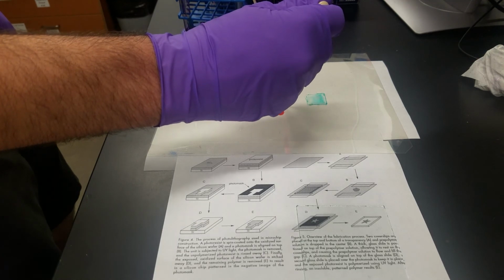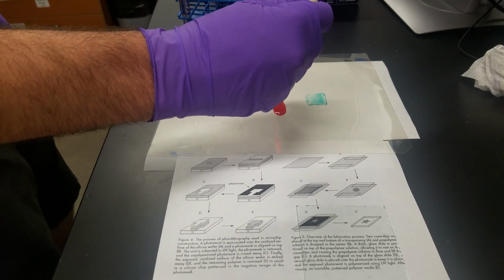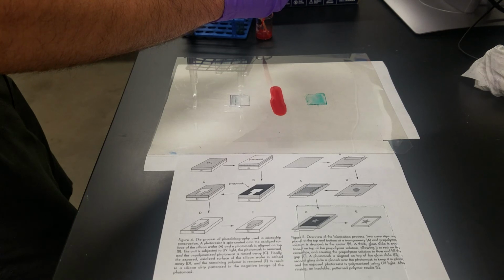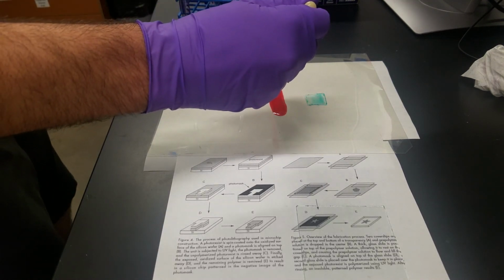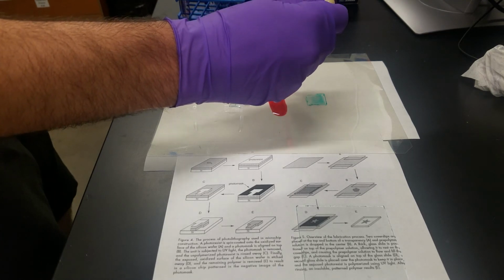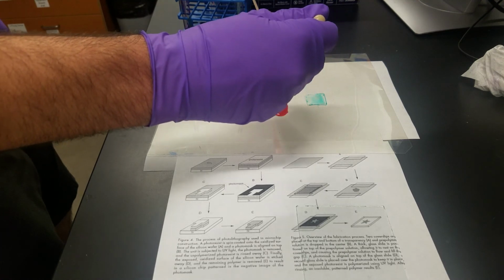In this case, I'm using a lightning bolt because I had it as a mask, and so I know that's running on the vertical axis. Based off of past failures, I'm trying to ensure that there's enough polymer mixture on that axis to allow us to get a solid lightning bolt with minimal air bubbles located within it too, which is why I'm condensing all of the polymer mixture on that axis and adding in an extra layer on it.